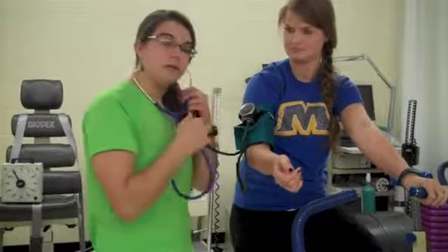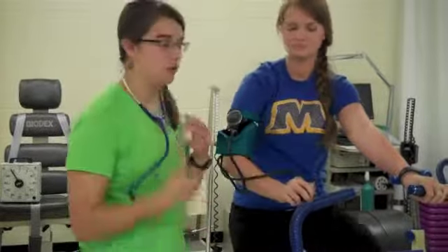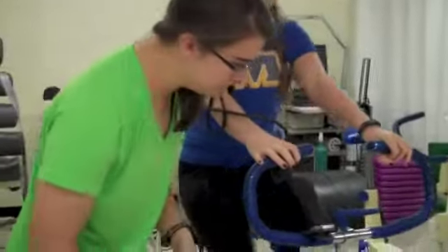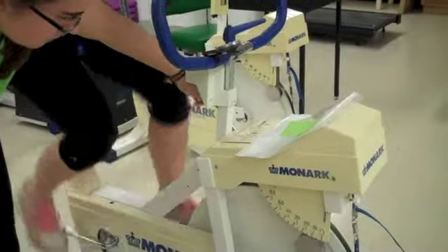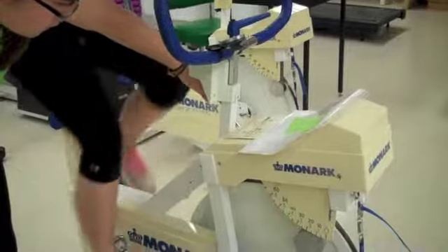Ashley's blood pressure was 124/84. I'm going to ask that you hold this because we're going to take your blood pressure throughout other stages. Since her heart rate was 95 at the last minute, we're going to raise the resistance up to 1.5 kilograms. So we are now at 1.5 kilograms, and in a minute I will take Ashley's heart rate again.